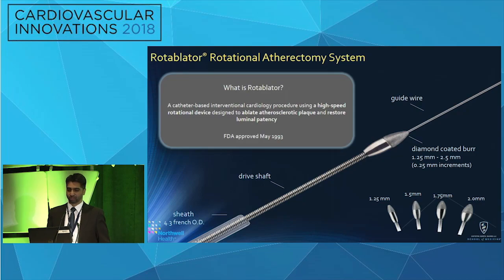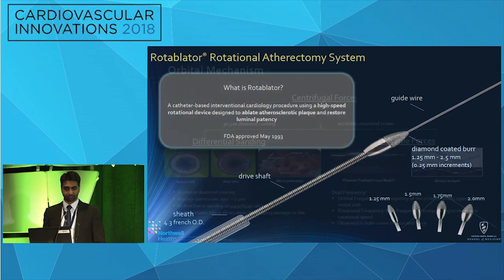So we know that rotablator, tried and true tested, has been around for over 25 years. It's a catheter-based interventional technique, a high-speed burr. It's diamond-coated on the front tip, ranging in size from 1.25 to 2.5 millimeters. And it's been used for a very long time for debulking and improving PCI success.